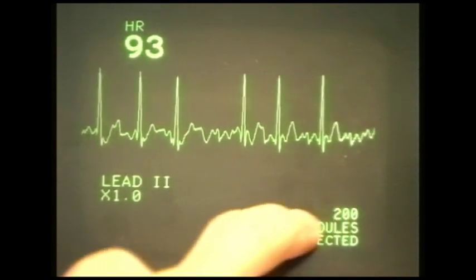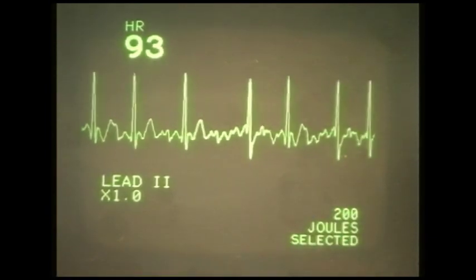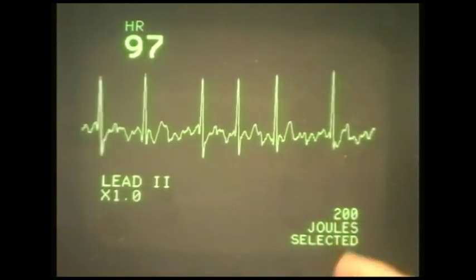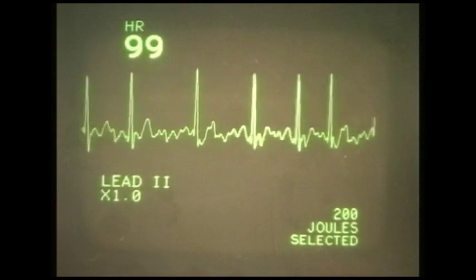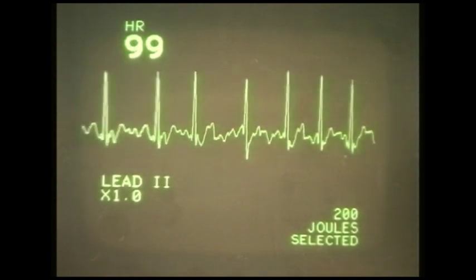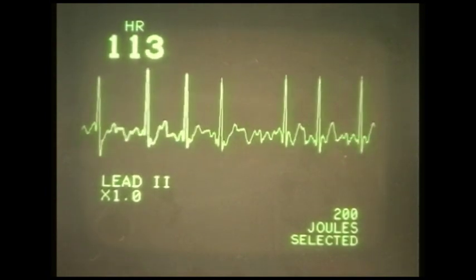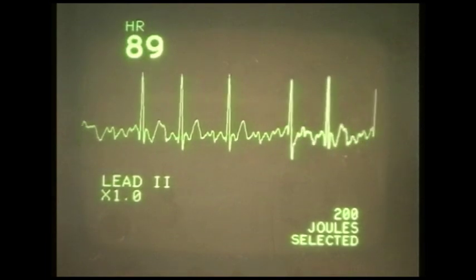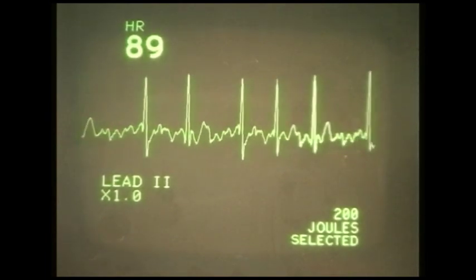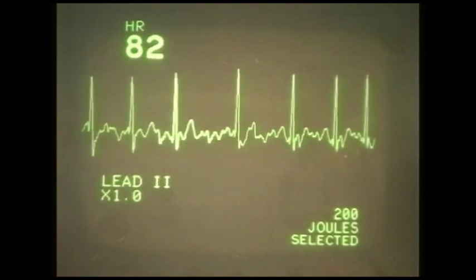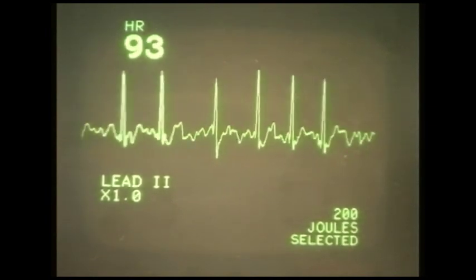Just notice one thing. What's this symbol here on the bottom right-hand side of the screen, David? This 200 joules. 200 joules. Because we're watching on a monitor that's also a defibrillator, the machine always defaults so that it has 200 joules of energy to charge up straight away as soon as you switch it on.